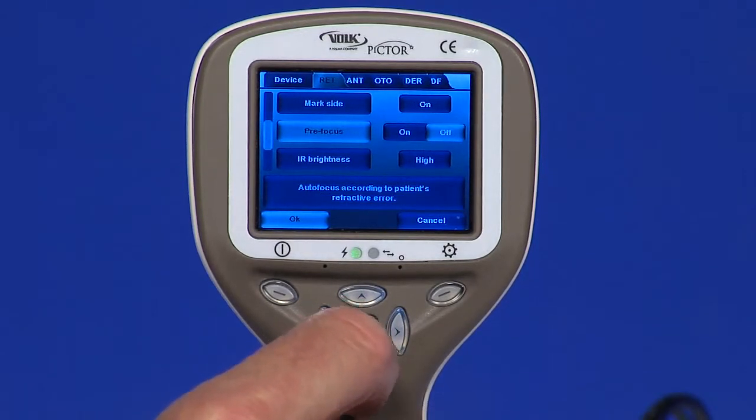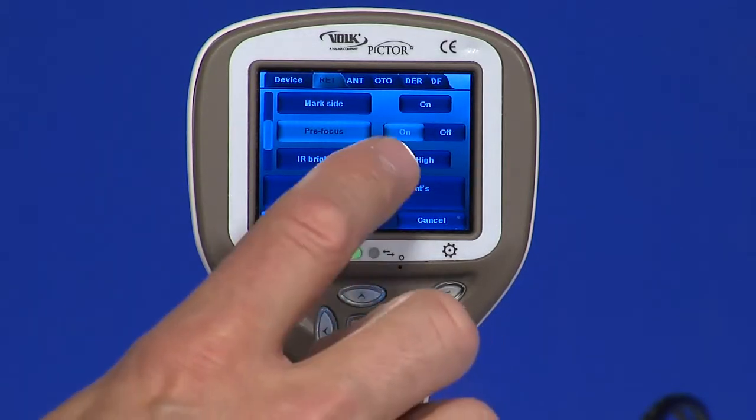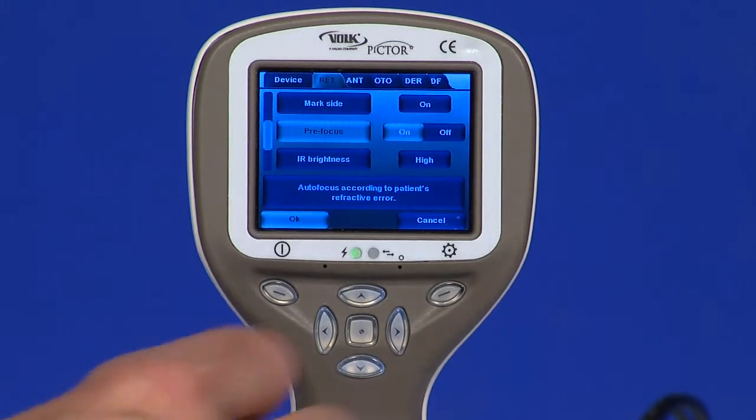Pre-focus. The pre-focus function is only used in auto mode. Pre-focus prevents the user from taking images that are out of focus. When the pre-focus feature is enabled from the menu, the camera prompts the user to focus again if the focusing failed. It is recommended to keep this feature turned off and shoot in manual mode.